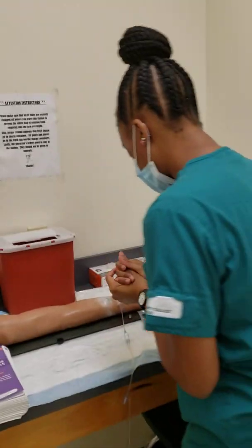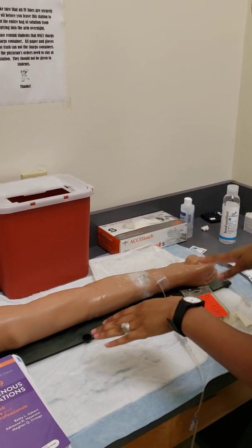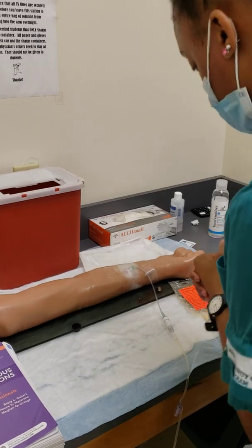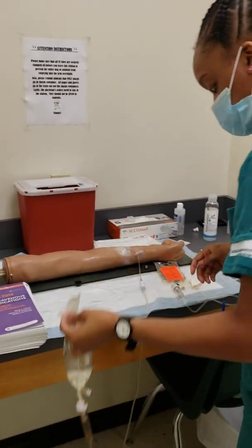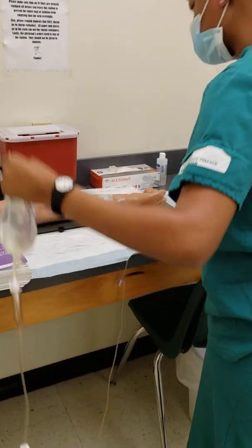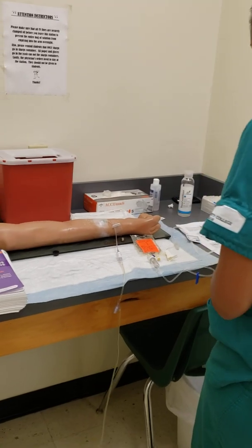Okay, and I'm gonna go ahead and assess my IV site, and I do notice that she does not have any infiltration, phlebitis, or redness to her site. And I'm gonna go ahead and lower the bag to check for patency. Okay, and she has blood return, so it's patent and her IV site is intact.